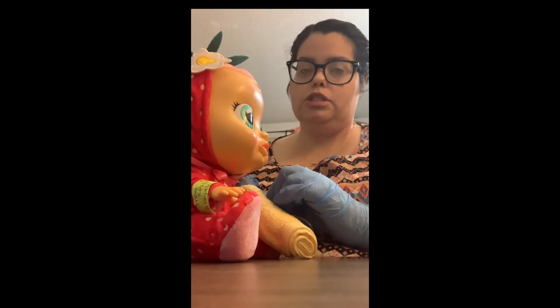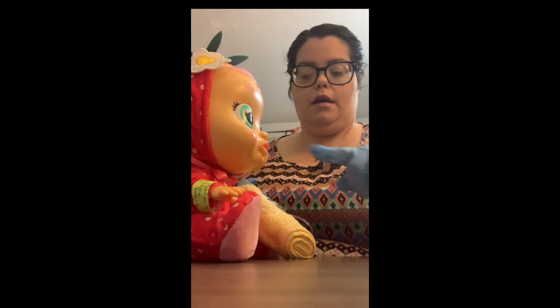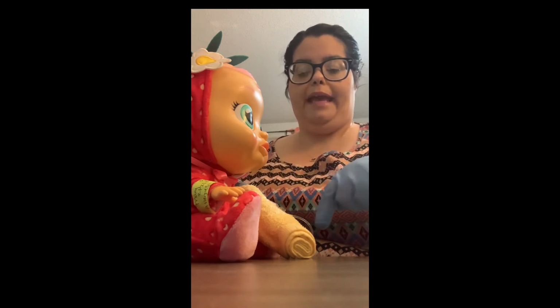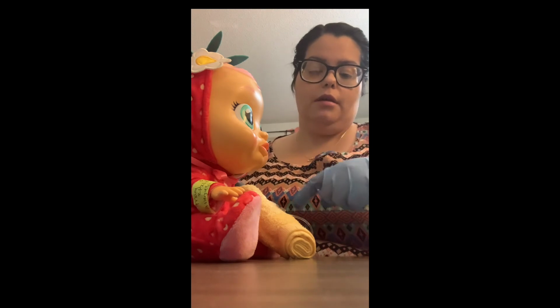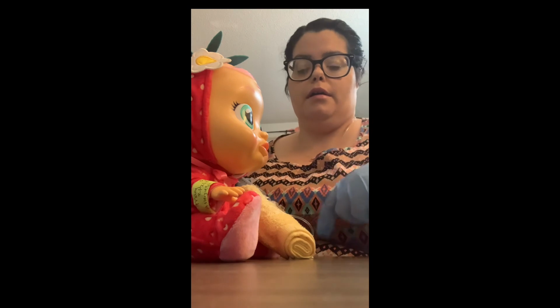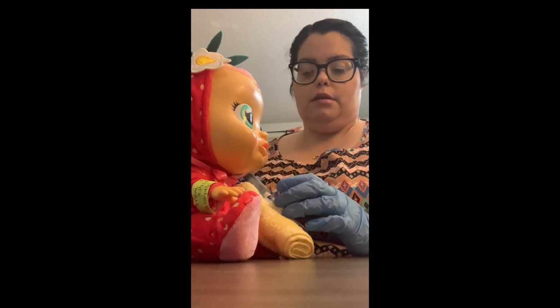and then the flush, we also want to give it at the same pace we gave the medication, because there is still medication in the IV line, so we want to make sure we are pushing it slow.